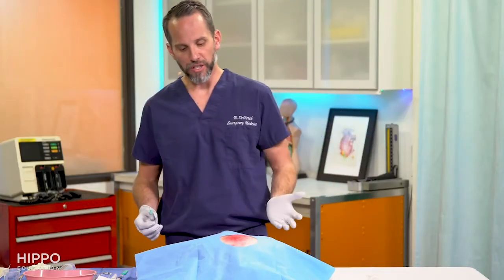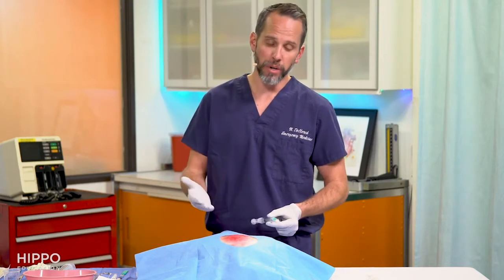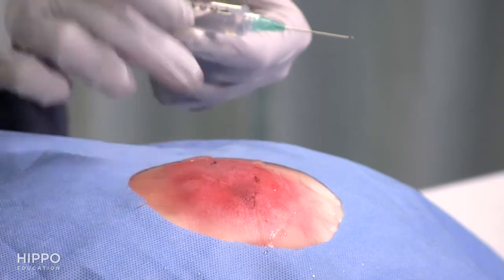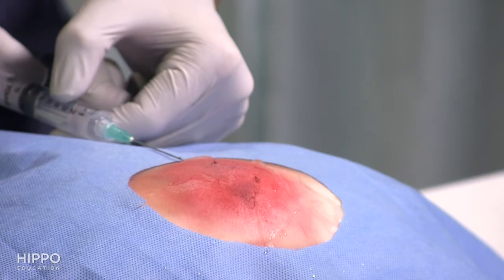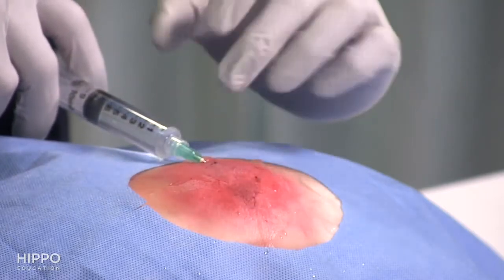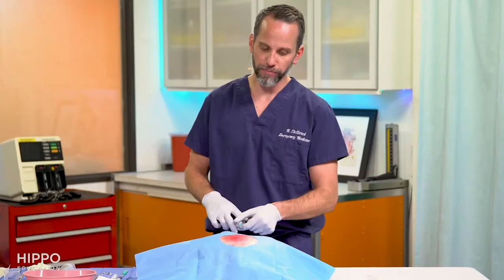I won't do this end just for time's sake, but the last part, after you've gone completely around to the starting point, is going to be infiltrating the dome of the abscess. Pretty much you're going to be making your incision at the point of most fluctuance for this abscess. I'm going to feel it, and basically that's going to be at that area right there. In terms of making that dome infiltration, again, I like to start somewhere anesthetized, but you're going to be putting it into the skin. Be aware this may be painful because you're infiltrating an area that's tender and swollen, and just injecting in that area as you move along where you plan to do your incision.